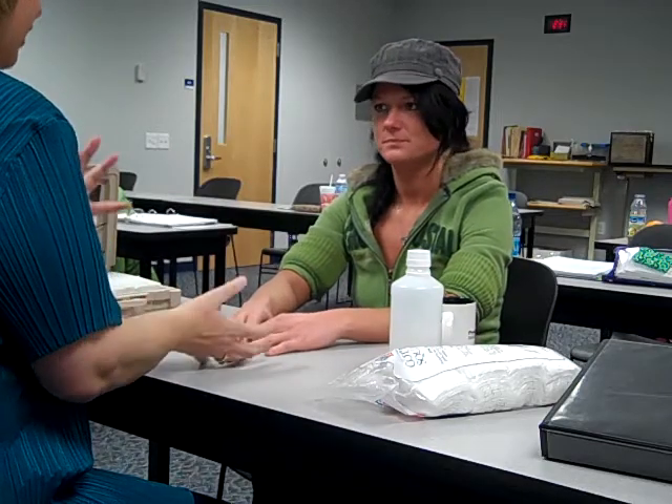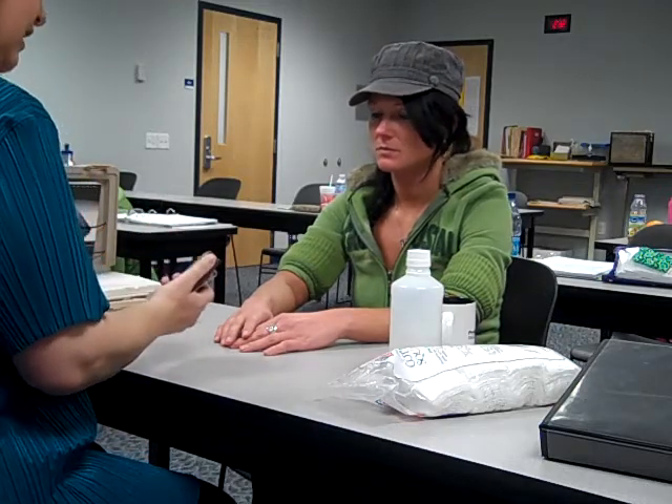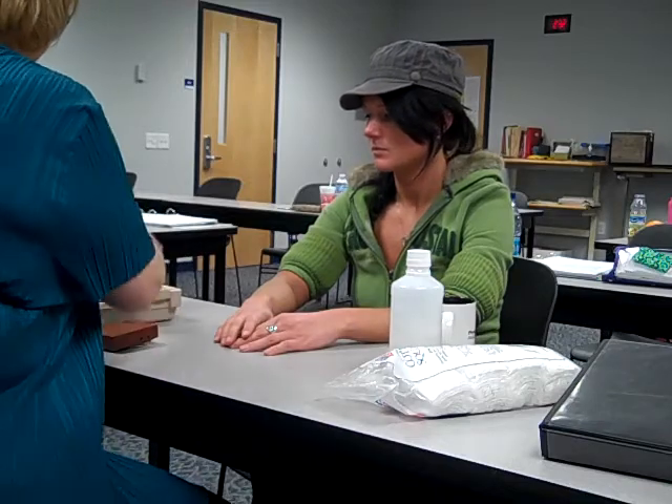If you were going to put a number on it, where zero is no pain and ten means you need to go to the emergency room, where would you say your pain is? Oh, like an eight. Eight — so it's pretty strong pain. That helps me know how to set this up to get the very best response for you. This is going to work really well because it'll make your brain think about the buzzing sensation instead of the pain.